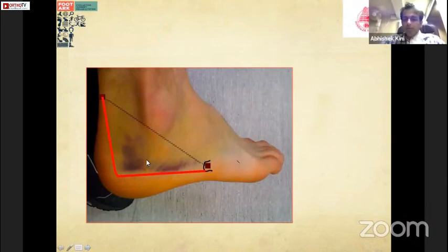When I put an incision, it has to be slightly obtuse. It has to be at the skin crease. How do I decide my superior extent? From the inferior end of lateral malleolus and the fifth metatarsal base.